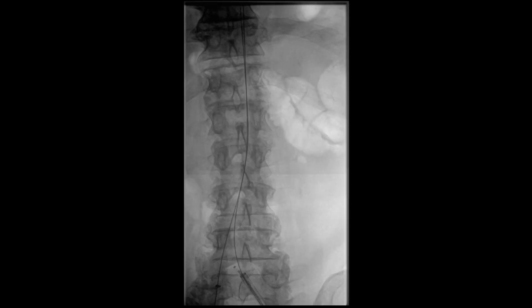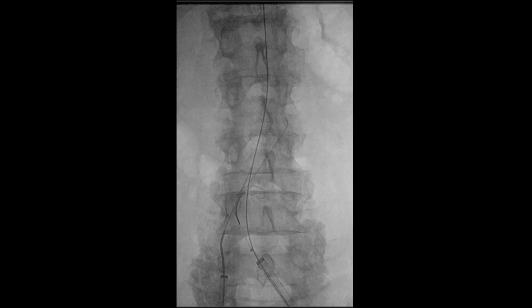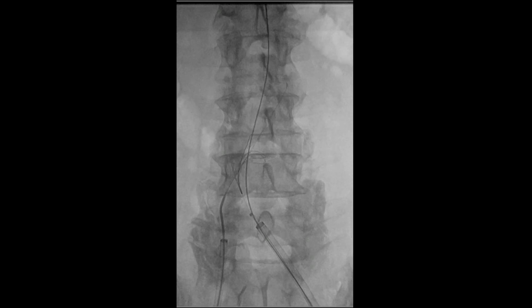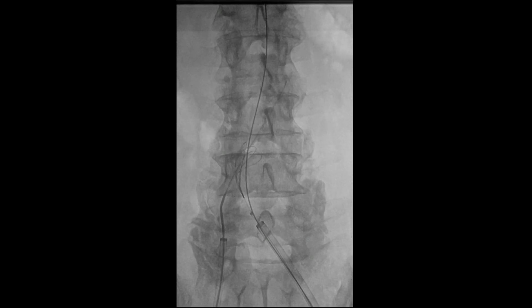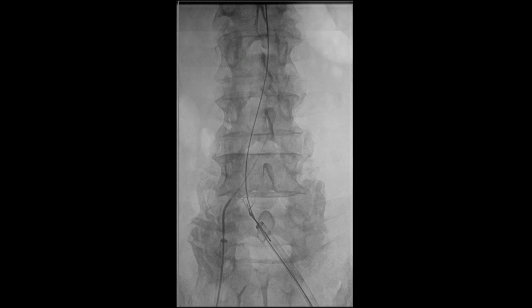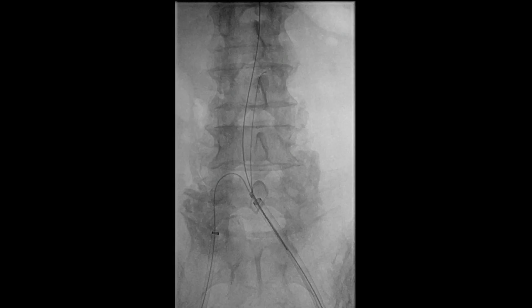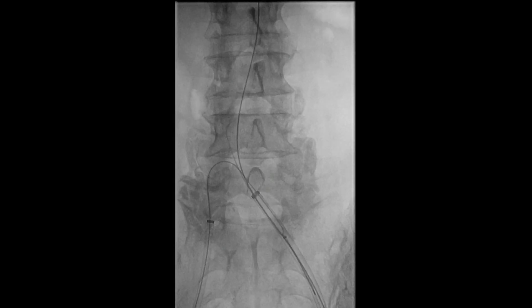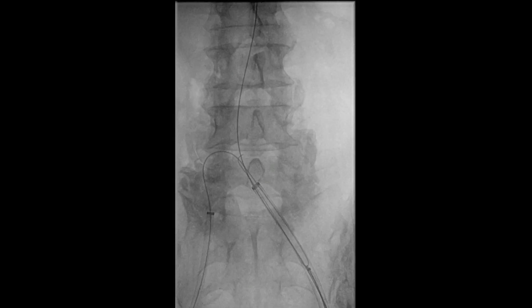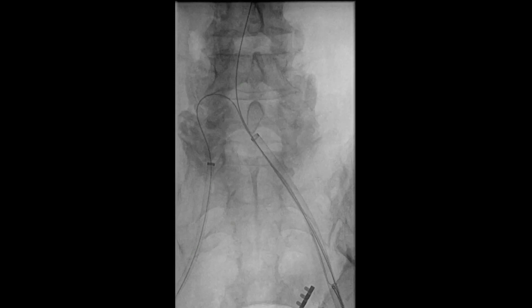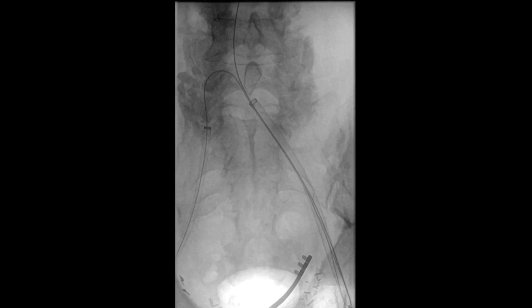We then introduced an endo snare from the left common femoral artery access site. This was done to snare a wire from the right common femoral artery, providing through-and-through wire access from the right common femoral to the left common femoral artery. This would later provide support for a sheath to be brought over into the left common iliac artery and to allow for placement of the internal iliac artery stent.